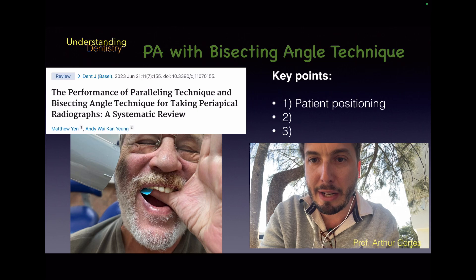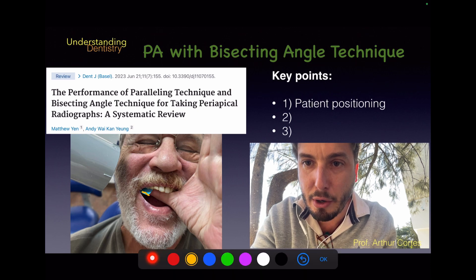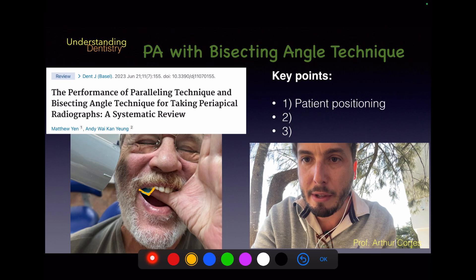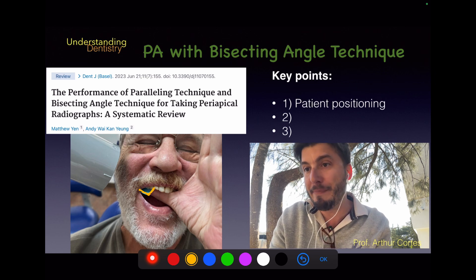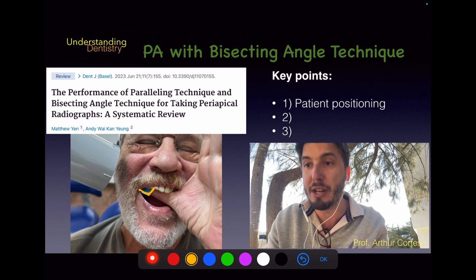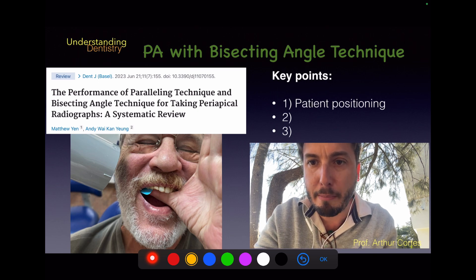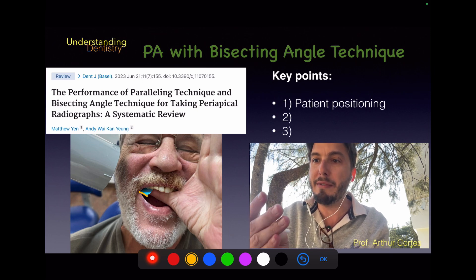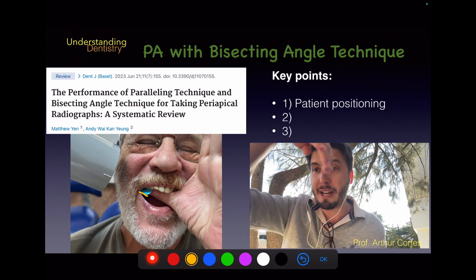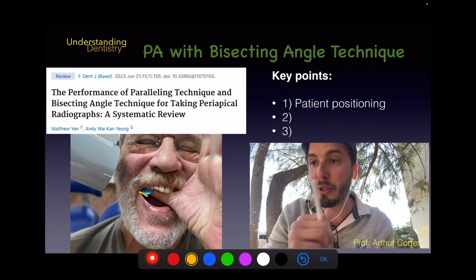Let's say we want to take a radiograph of the premolars. The inferior limit and the mesial limit of the film are identified. You can always retract the cheek and lip of the patient to confirm the film is covering the area of the teeth you want to image. The inferior border of the film should not be too far from the cusps — you may need to push it a little further up.